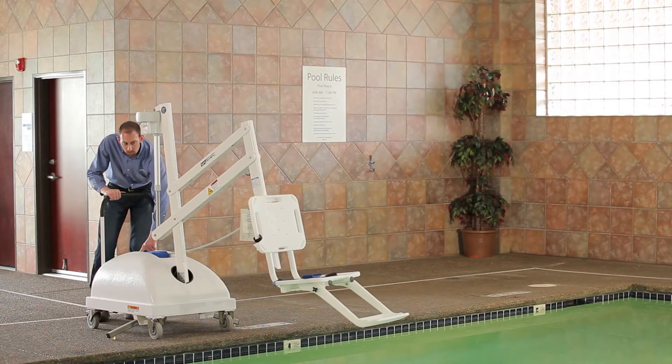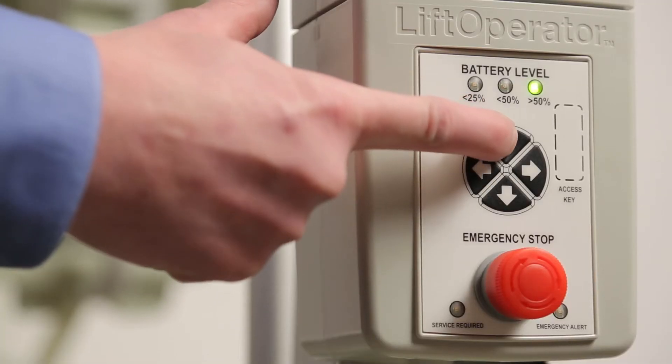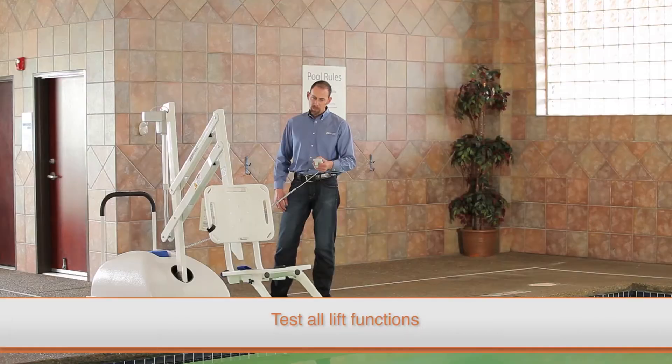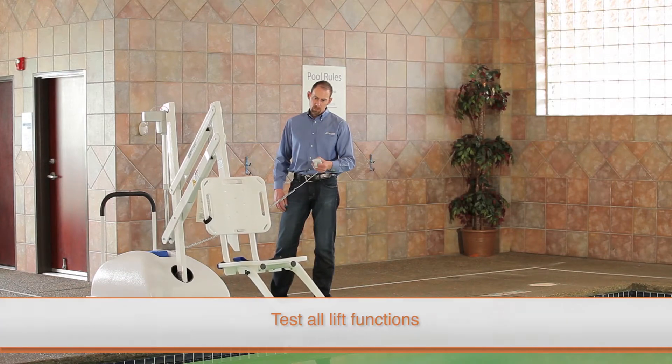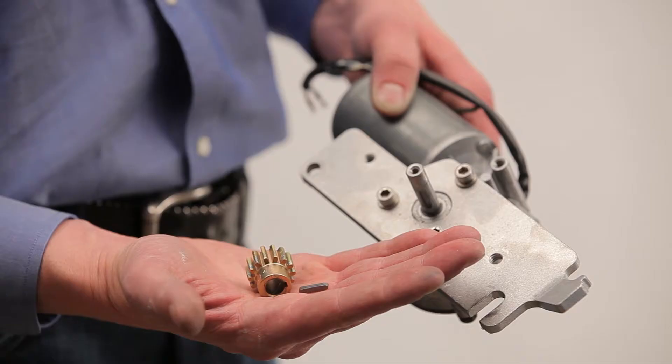Confirm you have installed all replacement parts and reassembled all components properly. Test all lift functions with both the touchpad control and the hand control to ensure the lift is operating properly.